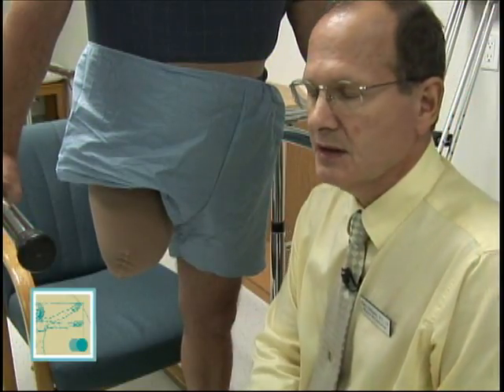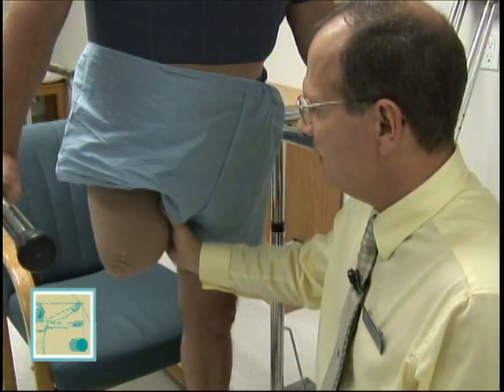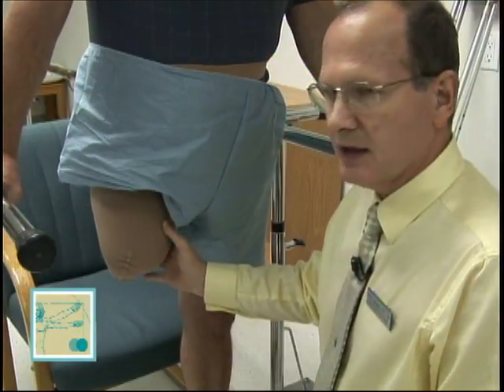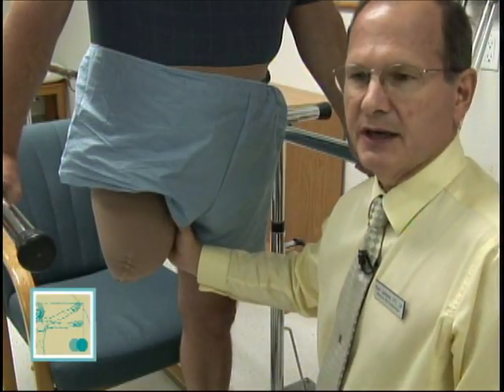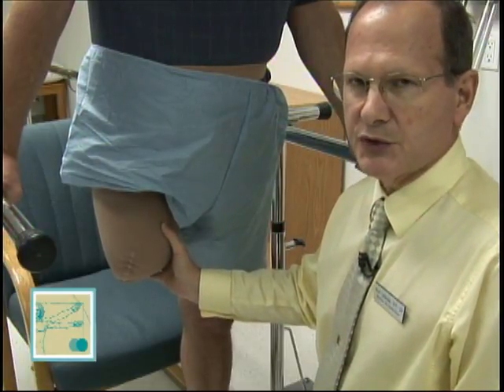We're now going to demonstrate ACE wrapping on a transfemoral amputee. Typically you'll only be doing this on a recent transfemoral amputation — there's really no need to ACE wrap limbs once they're wearing a prosthesis. When you have orders to ACE wrap this limb or provide some compressive therapy, we apply a very loose-fitting compressive shrinker over whatever wound dressing they have on. Why not just use a compressive shrinker? Well, for it to be effective you would have to pull all the pucker out of the seam for there to be enough compressive therapy to have any meaning, and on a post-operative case you could never pull it up that tight because it would hurt. So we fit a very loose compressive shrinker on the person's limb right over whatever wrapping they have on, and then ACE wrap over that.